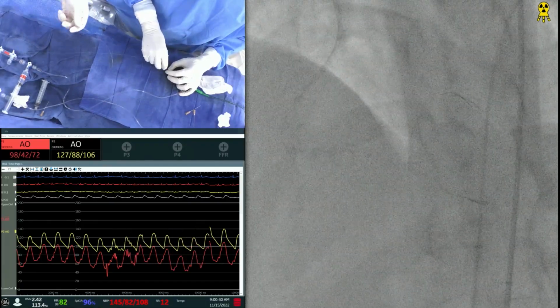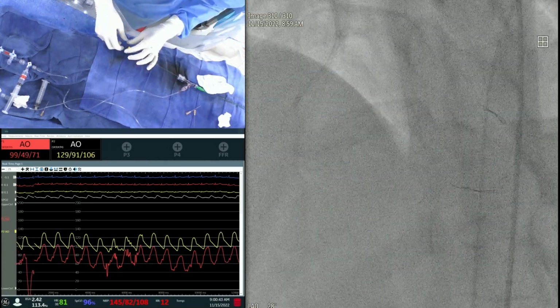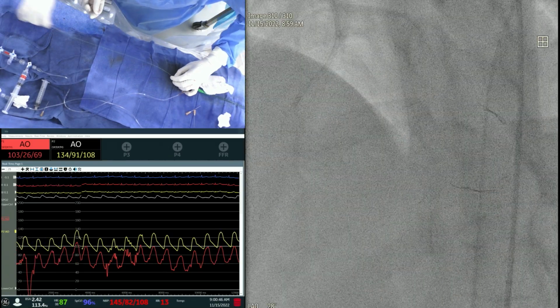Good. Okay. That was the wire we crossed with. Give me a 2 or 12. You're right here.